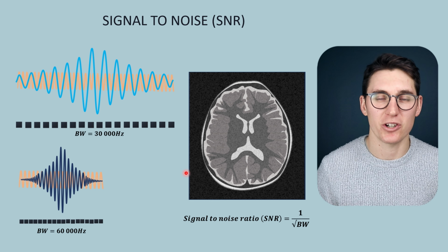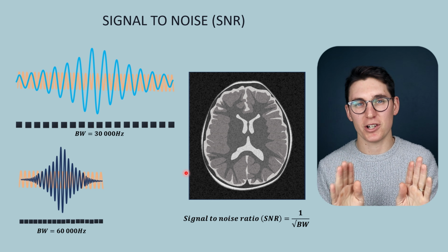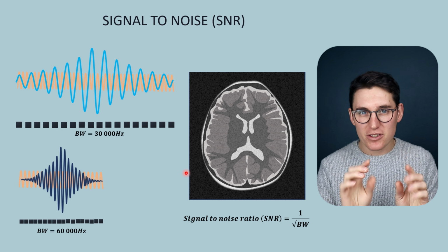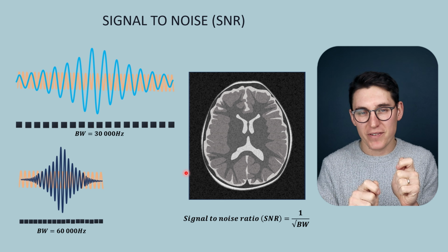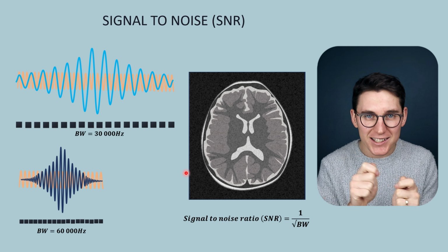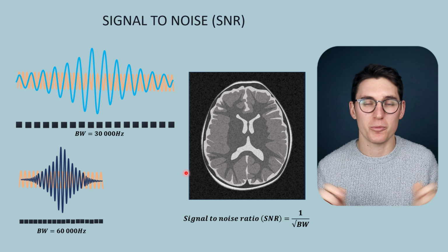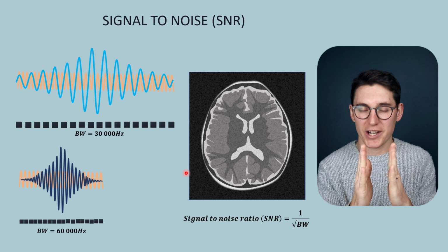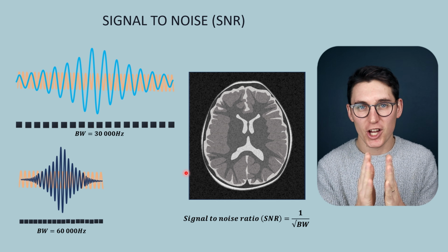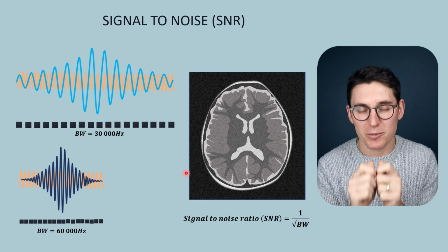And there's an artifact that we're going to look at later called the chemical shift artifact, where we look at water and we look at fat. We see that because of the local conditions around water and around fat, the hydrogens in water and fat actually precess at slightly different frequencies despite experiencing the same external magnetic field. Now, if we have a high gradient, we've got quite a large range of frequencies within one pixel. So we can cover those differences in frequencies and still plot them in the correct pixel.